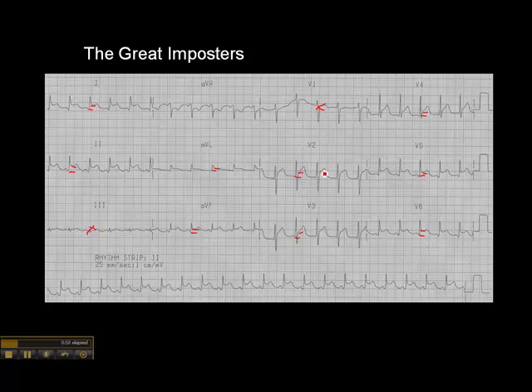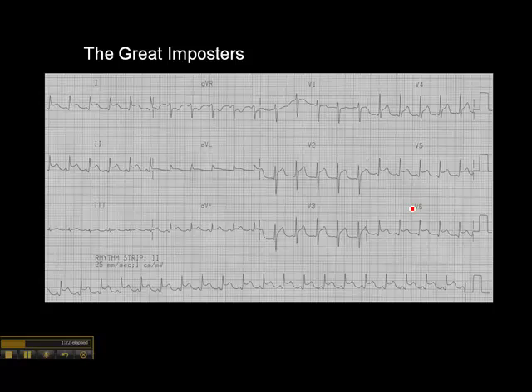ST elevation in V2, V3, V4 would suggest occlusion of the LAD. ST elevation in V5, V6, lead one, and AVL would suggest occlusion of the circumflex. But here's the reality — you cannot occlude your RCA, LAD, and circumflex and live to have a cardiogram; it's extremely unlikely. So the clinical presentation is very important.